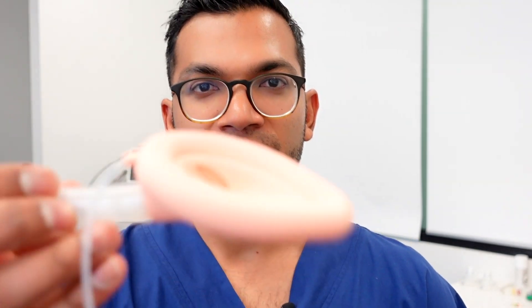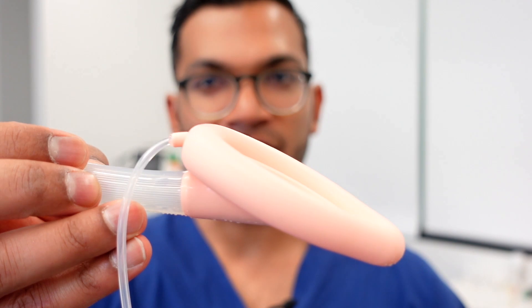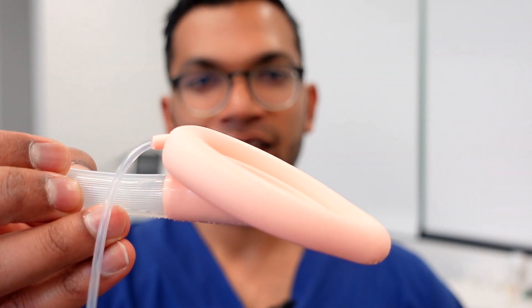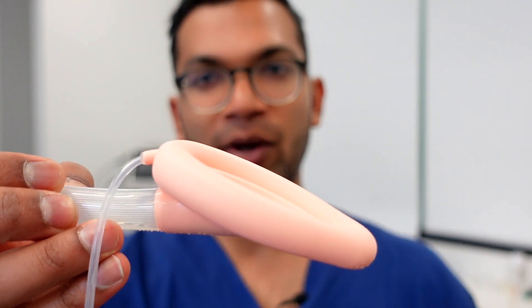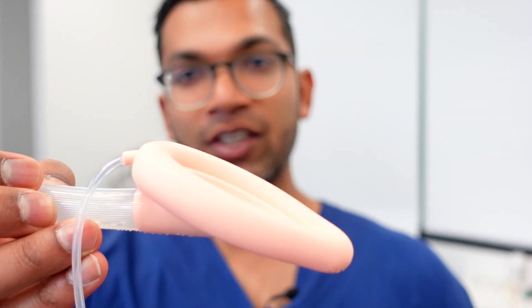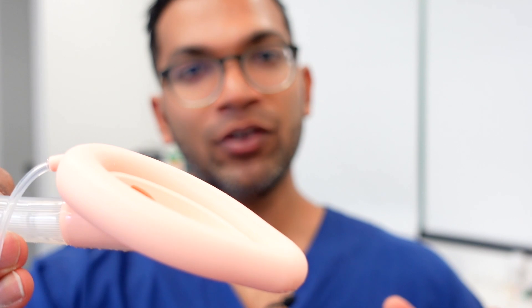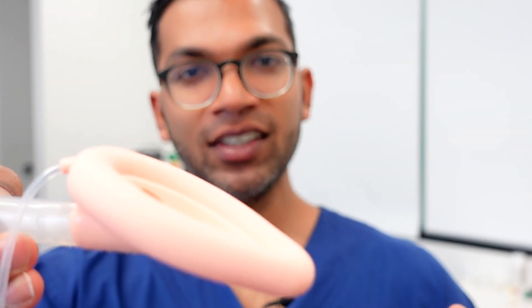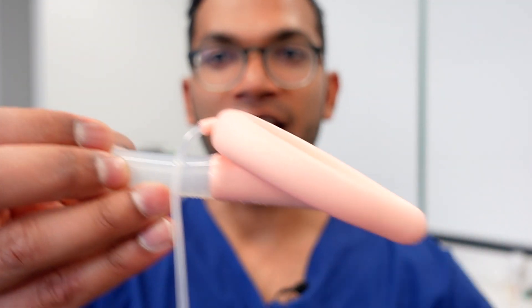A laryngeal mask airway is a device that sits over the trachea and the laryngeal opening, creating a seal which allows us to positive-pressure ventilate. Just like the bag mask or intubation, you're creating a seal with a certain structure and then using positive pressure to ventilate through this tube and inflate the lungs.